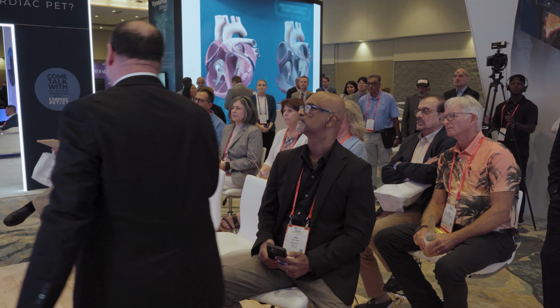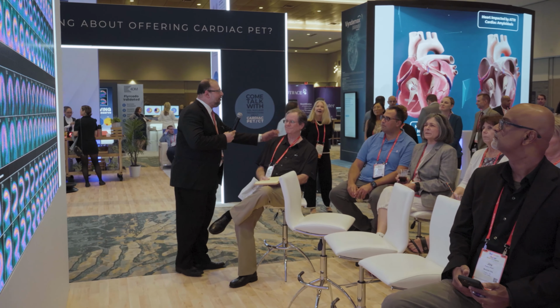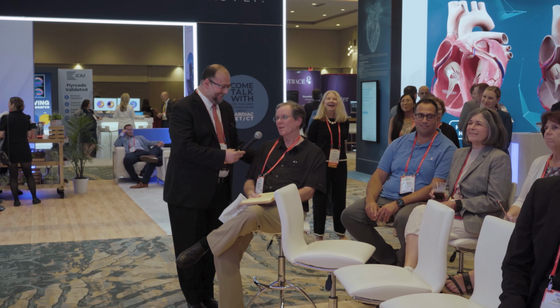Do you want to say it, Dr. White? I don't know. I've known Dr. White for a long time, so. Lateral wall. Lateral wall, fixed, reversible. Looks mildly reversible. So minimally reversible, totally agree with.